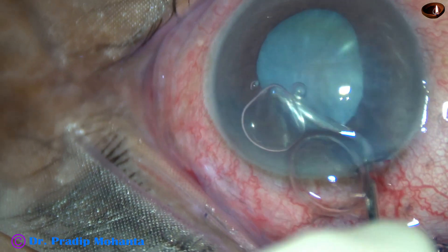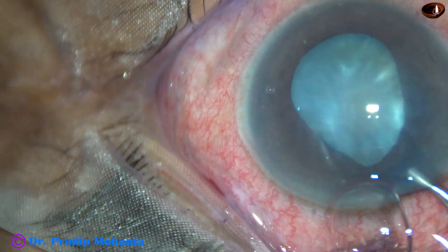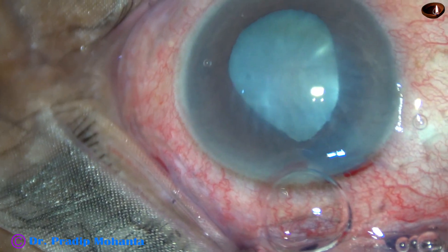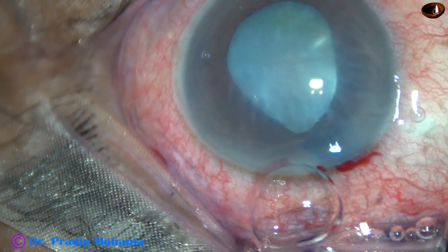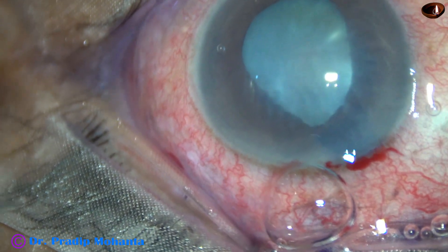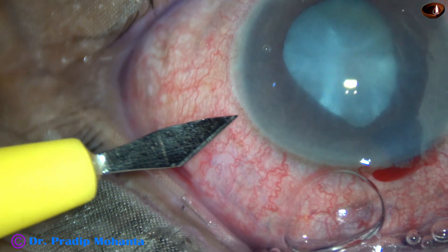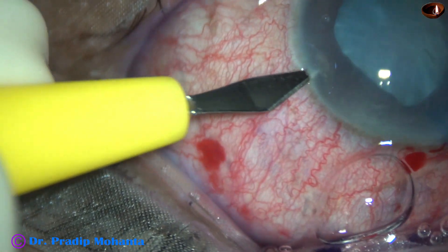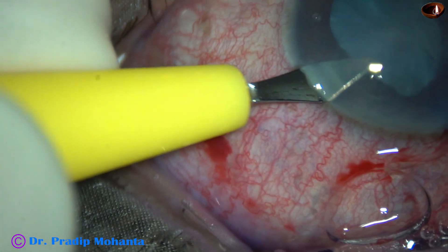In this case, my plan is to work far away from the corneal endothelium and use viscoelastic at every step. And now a side port is being made on the left side of the main incision, 2.5 clock hours away.